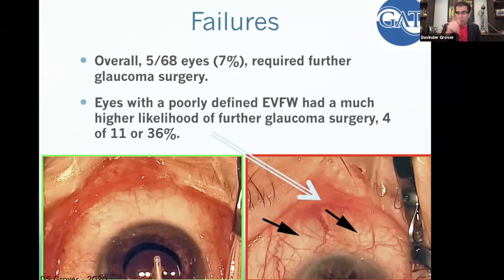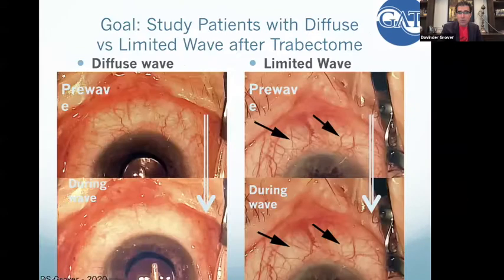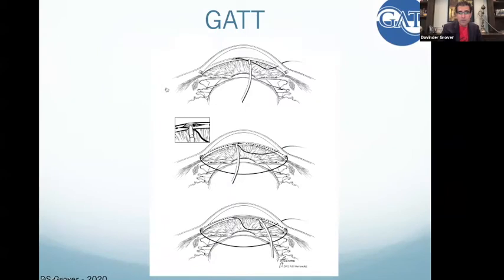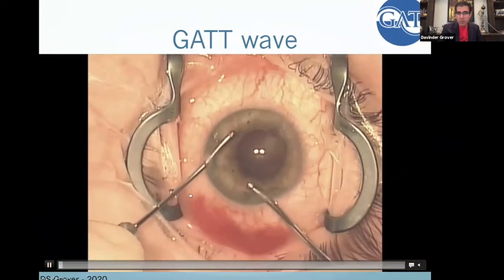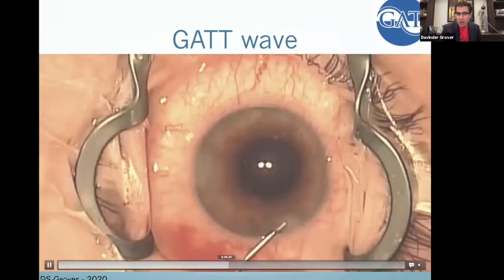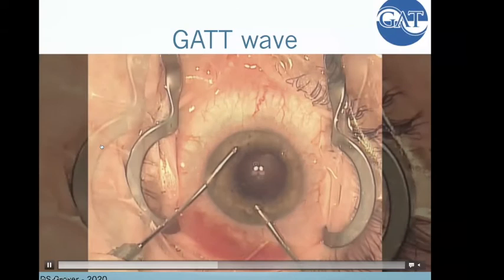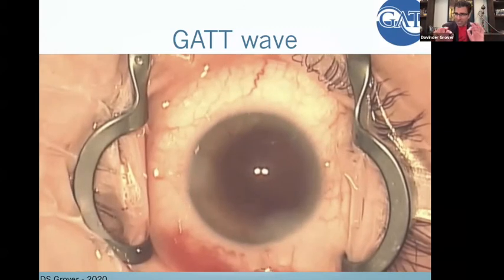So in that video that I showed, I was doing irrigation aspiration, and then afterwards, let me go back a little bit. This first part is just irrigation aspiration, normal bottle height, and you can see a little bit of the blanching right here. But then what I do later on is I go in with a cannula, and I pump up the pressure very high, and it's almost washing out the system. So that pressure there, you can see it's about 30 now.